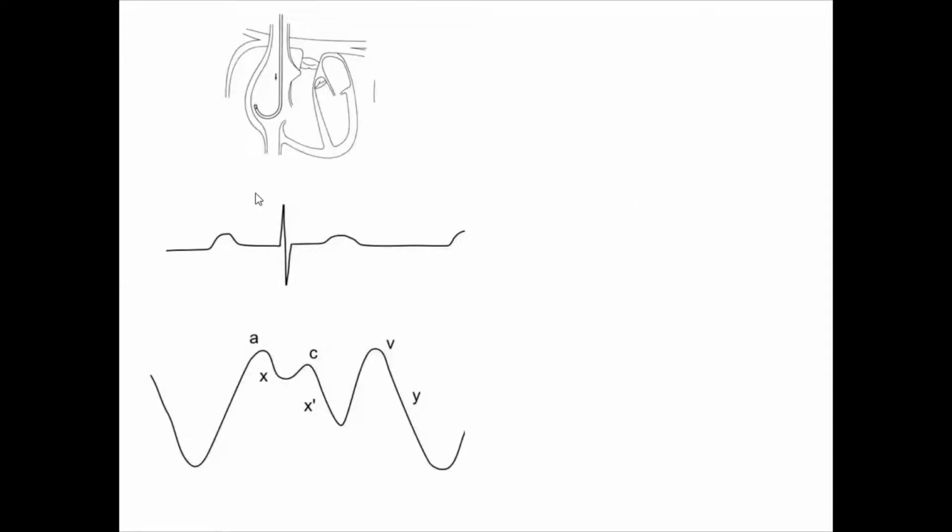Usually we go for the right heart catheterization either from the superior vena cava or inferior vena cava to the right atrium. And as we said, we have to time our tracing with the ECG. As a concept, electrical events usually precede mechanical events. So when analyzing your waveforms with the ECG, keep in mind that these mechanical waves come a bit later than the electrical activity.